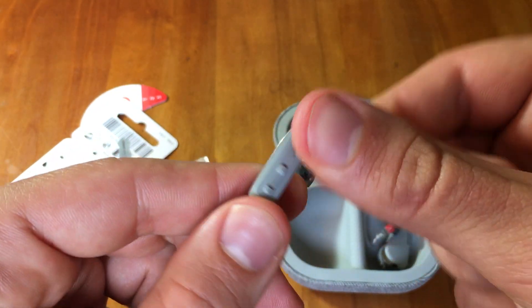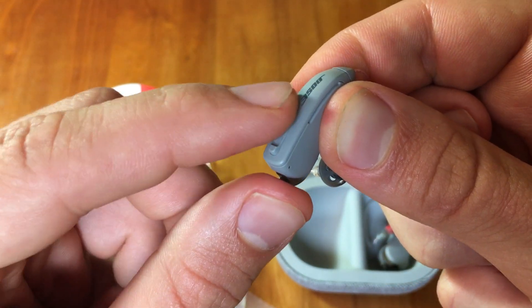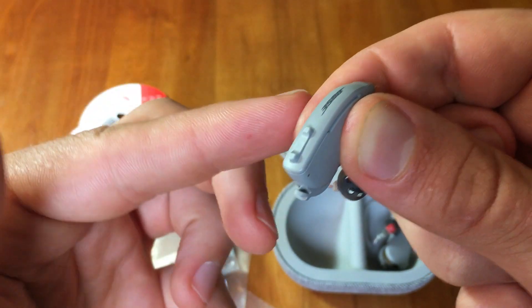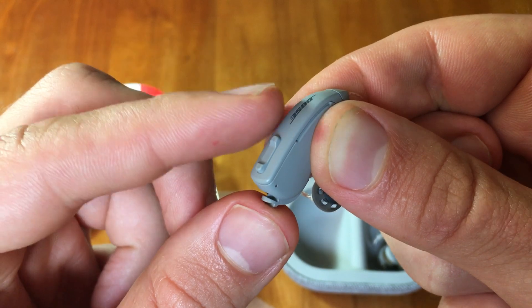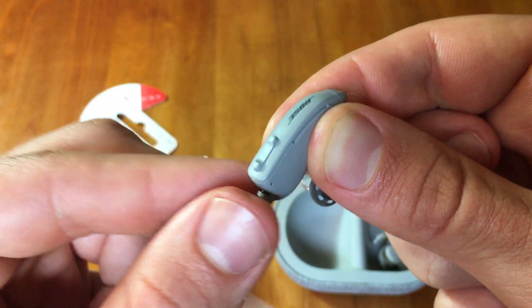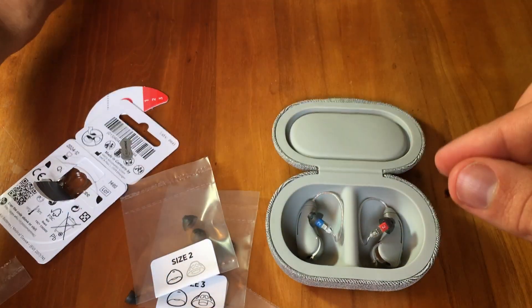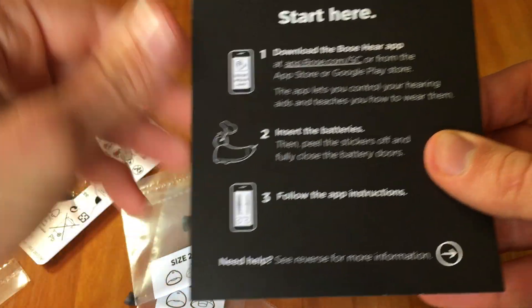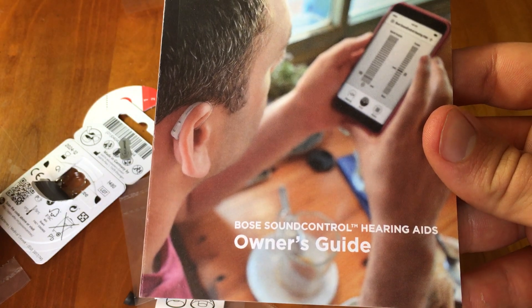I showed you how to change the battery. These buttons here are for changing the volume — tapping the up button will make the left hearing aid go louder, and tapping the down button will make it go softer. We also advise connecting these hearing aids to your smartphone, as the instructions will show you how to connect the devices.